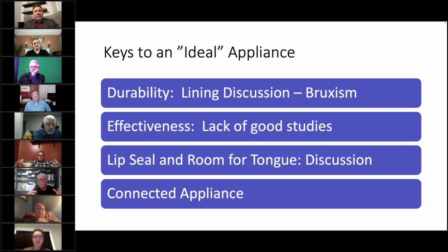Obviously, it's got the advantage if you're doing dentistry and whatnot. I think that's overstated. I think you can do any appliance, unless you're doing major dentistry, you know, 5 units into the bridge or more, then obviously the Thermaline is an advantage. But minor dentistry, almost any appliance can be adjusted. Maybe we should.